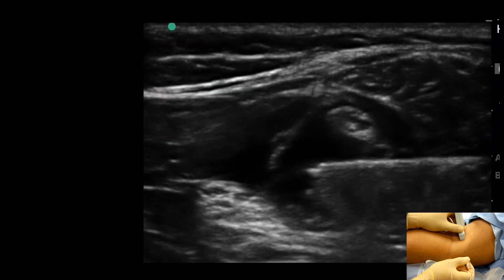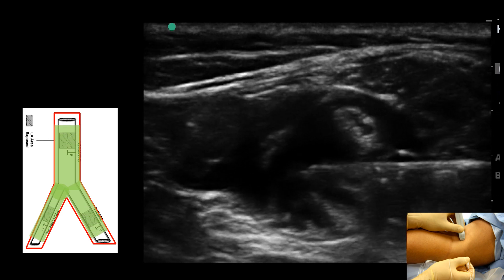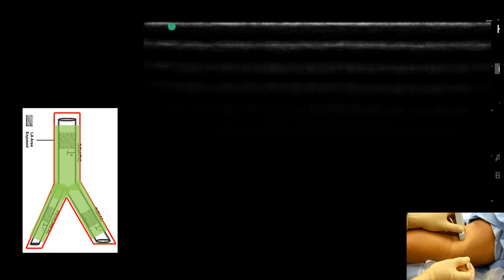The sheath behaves like a pair of trousers to direct and contain the spread of local anesthetic. If we are in the correct place, local anesthetic will spread up and down within the sheath. The full volume of 20 or more mL can be injected here.